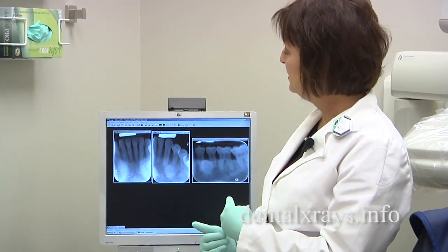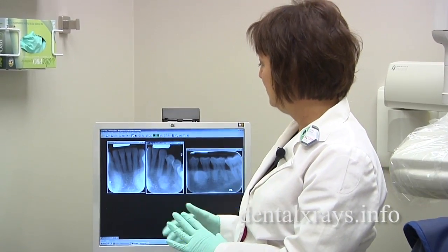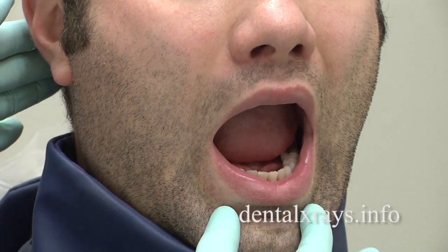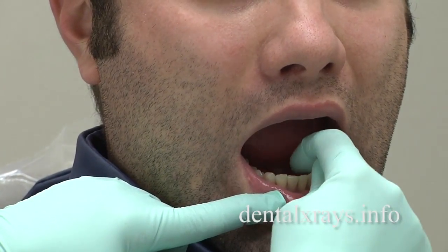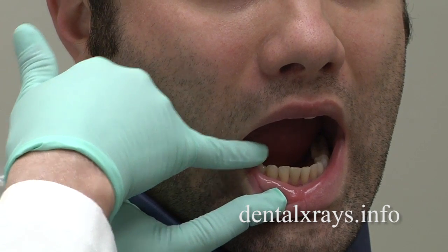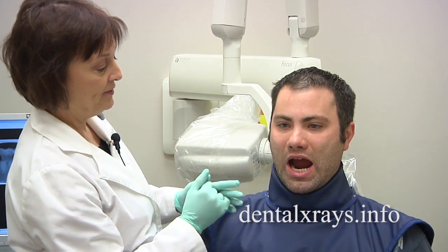You have to be able to get the x-ray in there to get the images of the teeth that you need, and this can be a problem sometimes, especially when those tori are very large. If you look inside the mouth, the bony growths are on the lower, right behind the canines usually. There are two large bumps there that can cause a problem when putting the x-ray into the mouth, so we'll show you some techniques to get around it.